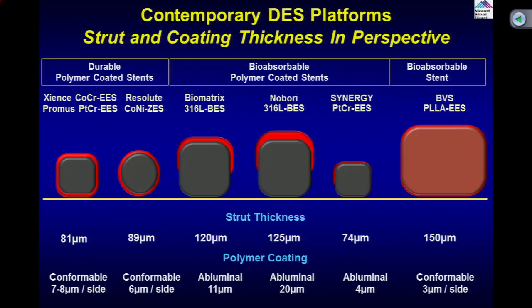Now, why is this all happening? Because to me, very simple mechanism. The mechanism is the size of the strut of the bioresorbable stent, which is 150 micron, almost double what we have for the Synergy, which is 74. So that's where the whole issue is. You have a thicker strut, so even if it gets absorbed, it causes more inflammation acutely, difficult endothelialization, and of course causes more thrombosis. So we felt that maybe with the BVS you have a lower death rate, which is not correct, because it takes 2 to 3 years to absorb.